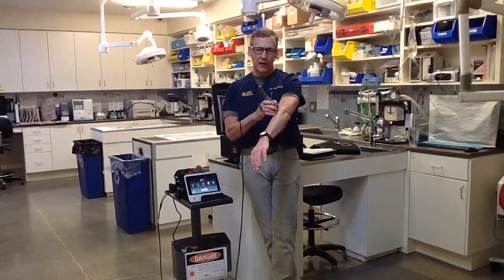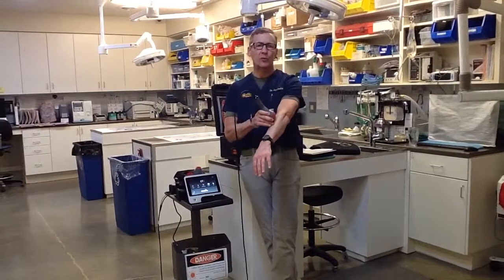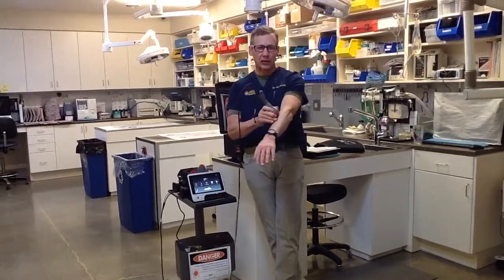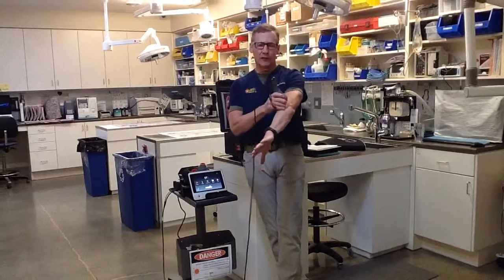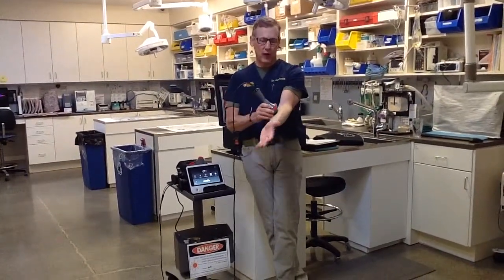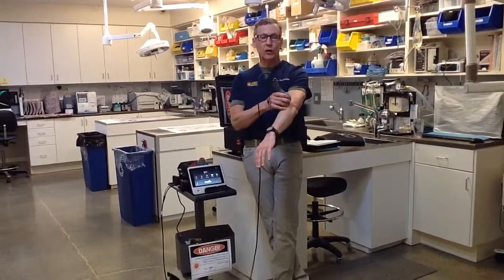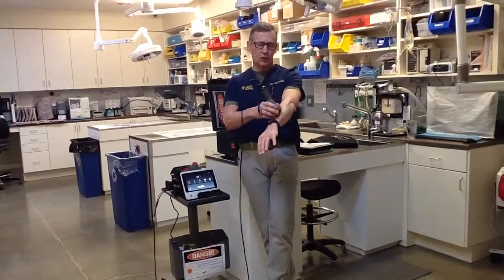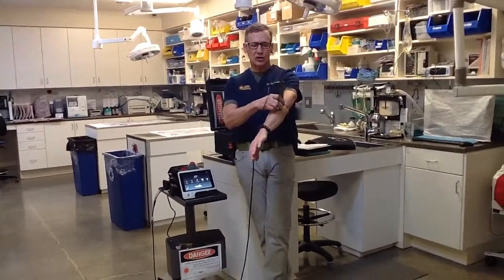When applying the laser, you want a little compression of the tissue. Slight compression is fine at first, but you can move to more of a massaging technique as your expertise develops. Perceive what it would feel like on your own skin or neck and get feedback from the animal about how much pressure they like. Once in a while an animal doesn't want to be touched — you can work one or two millimeters away, and once they've tolerated that for a minute or two, go into contact. The contact head lets you push through the hair, part it, compress the tissue, and introduce light directly.